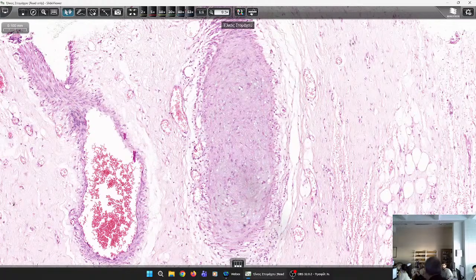that needs surgery to stop, because the thickened wall does not have the ability to close on its own as normal vessels do, so it is permanent hemorrhage, so you have to stop it. And sometimes you have to have a partial gastrectomy, including the vessel that gave you the hemorrhage. This is another complication.